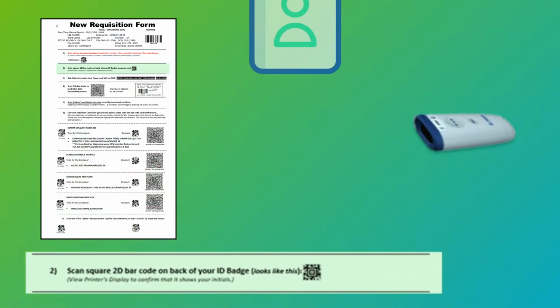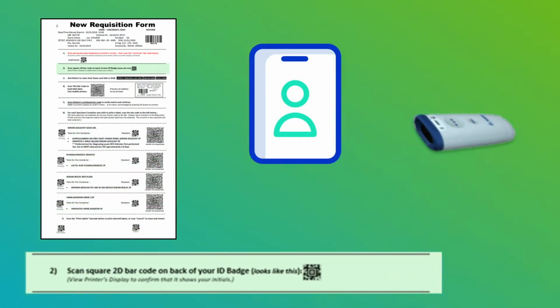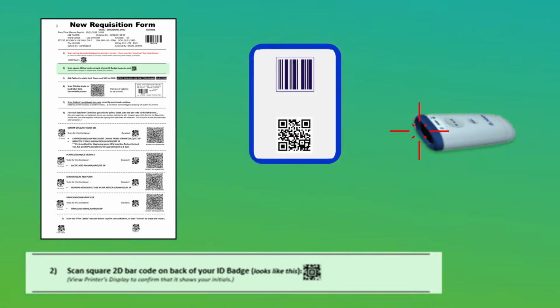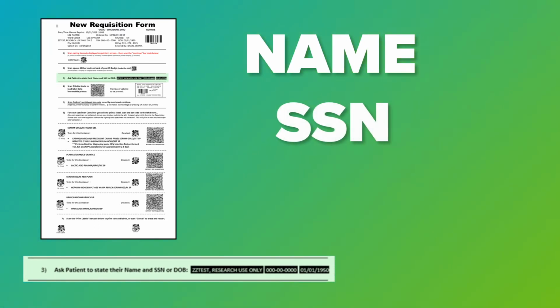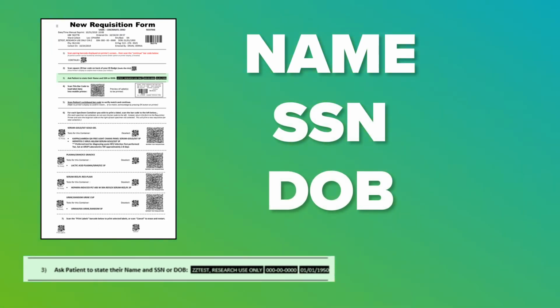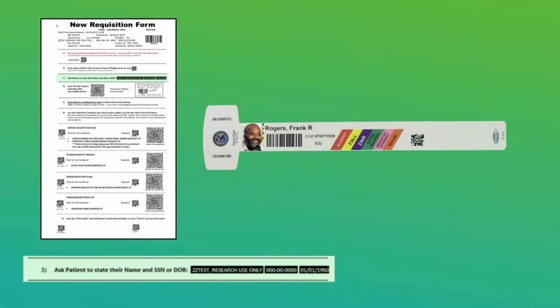Step 2 is to link the identity of the person collecting the specimens to the specimens being collected. This is accomplished by scanning a newly added 2D barcode on the back of an existing ID badge, such as their glucometer ID. Step 3 is to verify the patient's identity by verbally asking the patient's name and social security number or date of birth for those patients who are able to speak. And you can also visually compare the photo on the wristband to the patient, if the wristband contains the patient's photo.